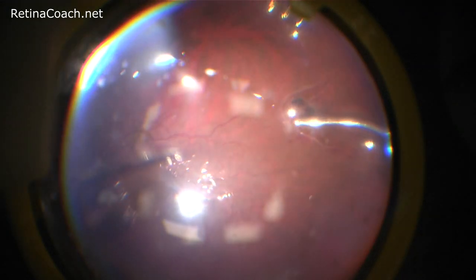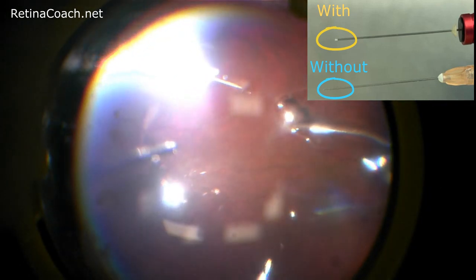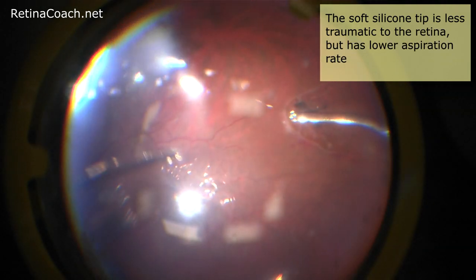When the retinal defect is closed, the remaining subretinal fluid will be slowly absorbed by the retinal pigment epithelium. A few types of cannulas can be used while draining subretinal fluid: the cannula with a silicone tip and without. The soft silicone tip has a smaller lumen and is flexible, thus less traumatic to the retina, but it has a lower aspiration rate than the cannula without a soft tip.